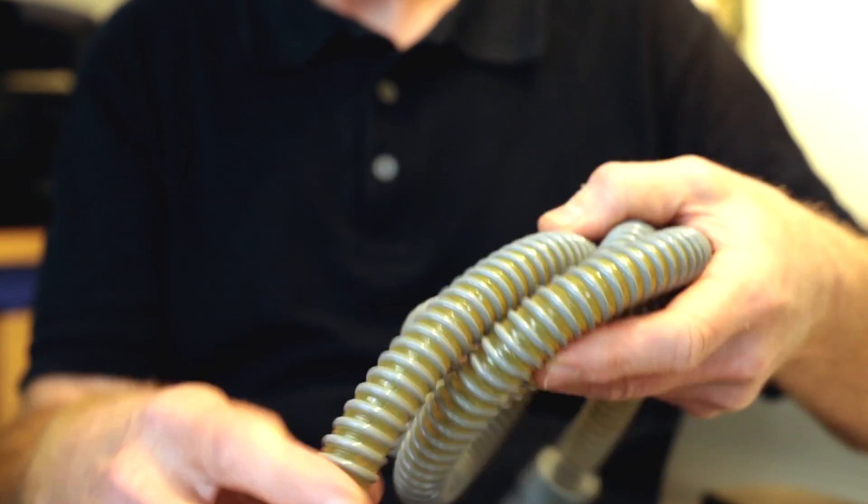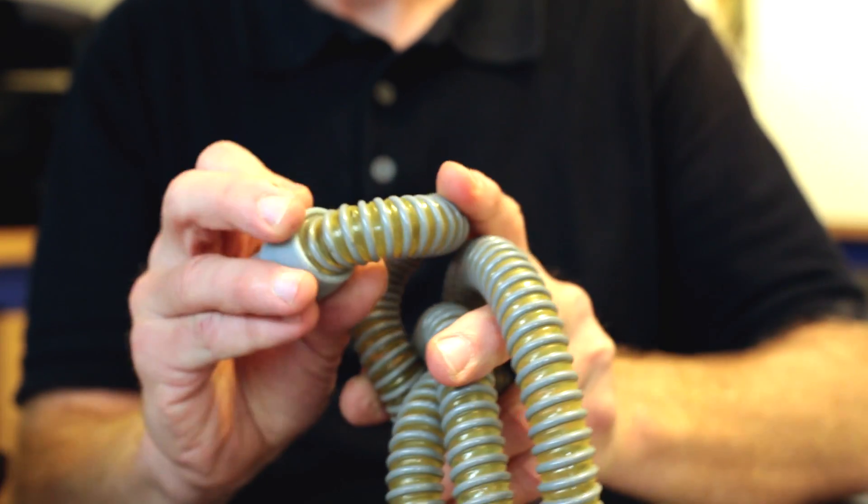Hi, if you're watching this video I guess I don't need to tell you anything about sleep apnea and CPAP — you know all about that. What I do want to talk about today is the hose. The standard hose that you're probably using is problematic to pack. It kinks very easily if you bend it too much.